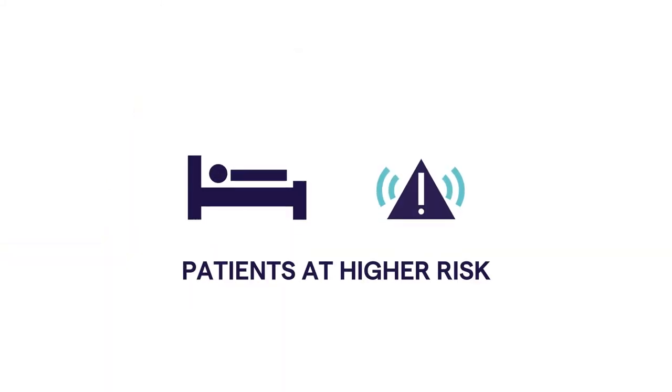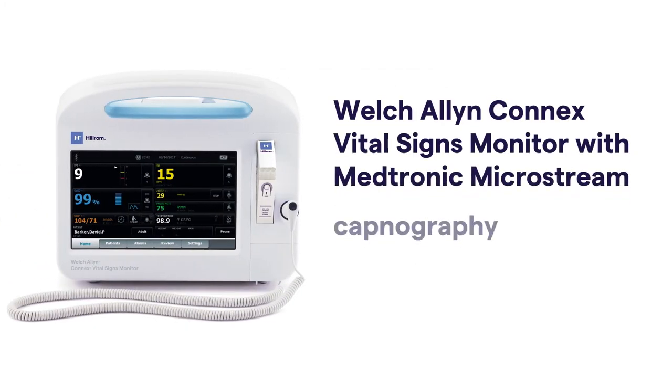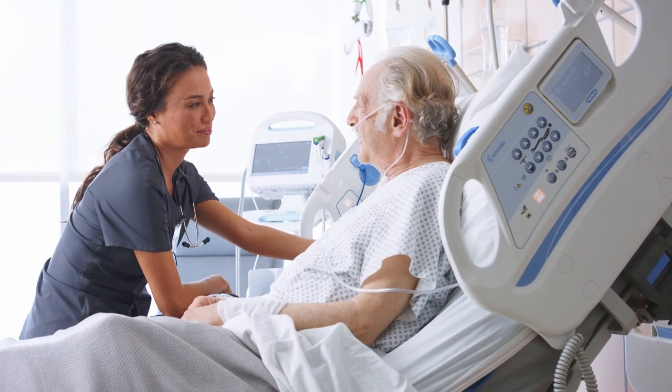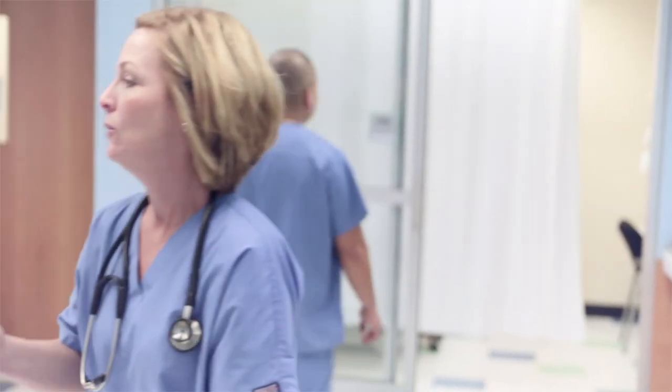For a patient at higher risk of decline, as indicated by the early warning score on the Connex Spot Monitor, the Welch-Allen Connex Vital Signs Monitor offers continuous capnography monitoring. Designed to monitor patient status 24-7, it reflects a change in ventilation within 10 seconds and alarms when measurements go outside of the clinician's set safety thresholds.